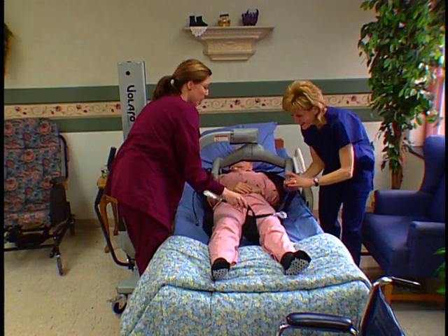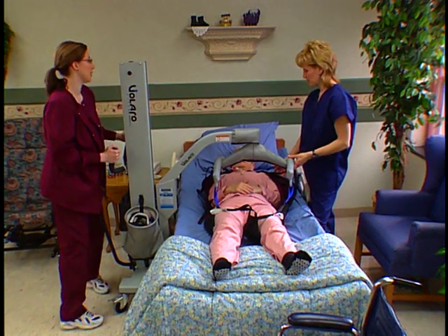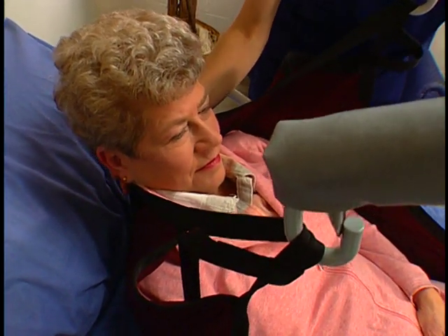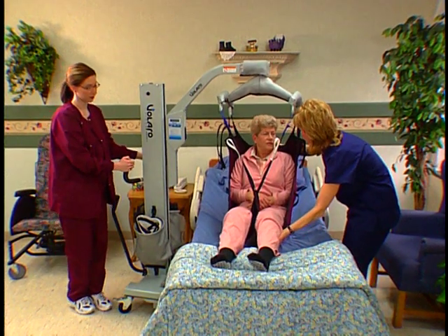Tell your patient that you are about to lift. Then lift. As you lift, double-check the sling around the legs. If the material binds, stop lifting and smooth the material. Make sure to check the person's neck. You may need to support the head.